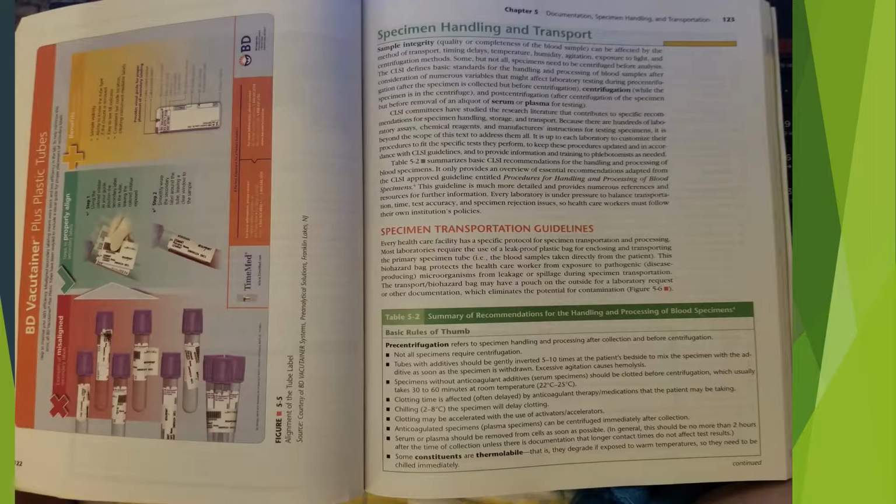It only provides an overview of essential recommendations adapted from the CLSI approved guideline entitled Procedures for Handling and Processing of Blood Specimens. This guideline is much more detailed and provides numerous references and resources for further information. Every laboratory is under pressure to balance transportation time, test accuracy, and specimen rejection issues, so healthcare workers must follow their own institution's policies.